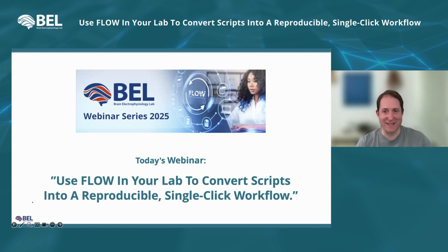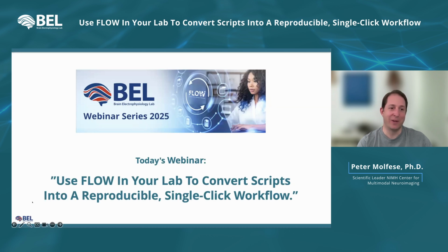I think this is amazing. Dr. Lorenzo, incredible work on this pipeline. The visualizations are comforting, to say the least. I know that there is a tendency in our field for all neuroimaging where people need to be looking at their data more. And I think this is a fantastic balance of looking at the data and also effectively cleaning, particularly infant EEG, which we have struggled with on our side as well.